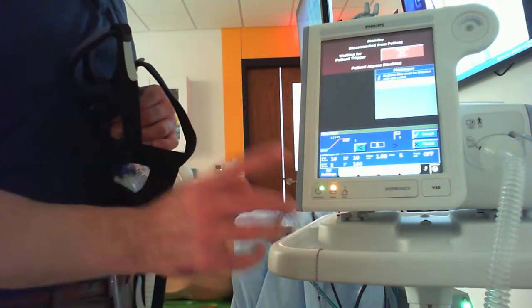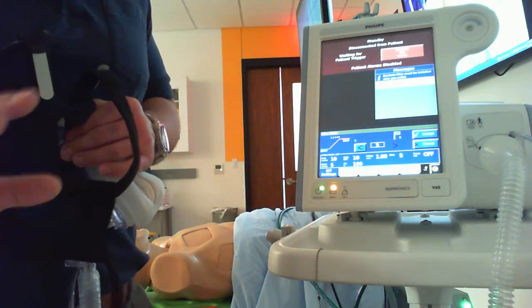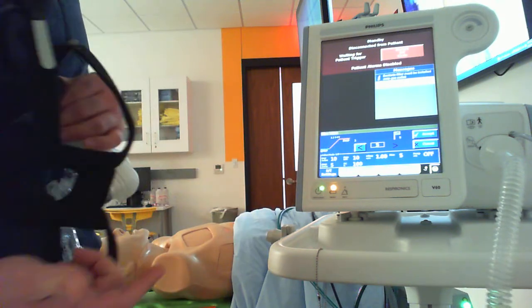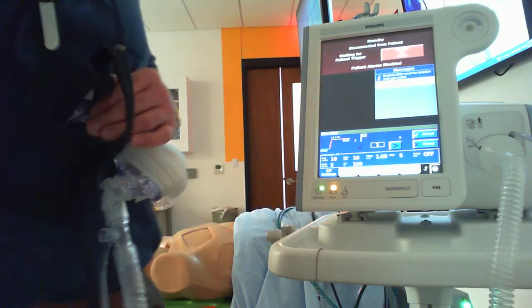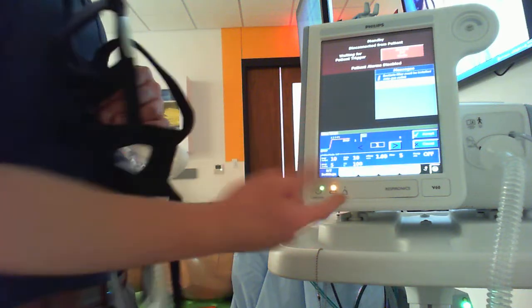Rise time is how quickly or how aggressively you reach your set pressure, so this is going to have a direct relation with how aggressive your flow delivery is. It's just an arbitrary setting, 1 through 5, but it gives you a little graphic. Most patients with a work of breathing or air hunger, we want to reach that pressure really quickly, give them a big burst of flow when they start the breath to fully support them, so generally 1 or 2.